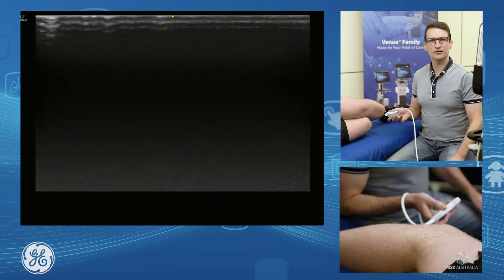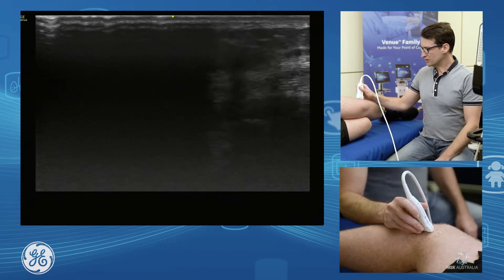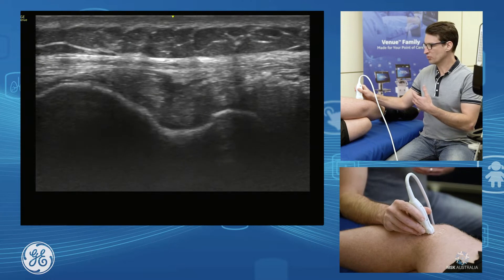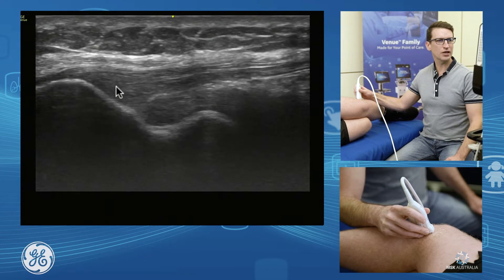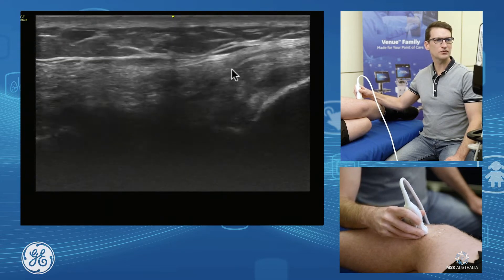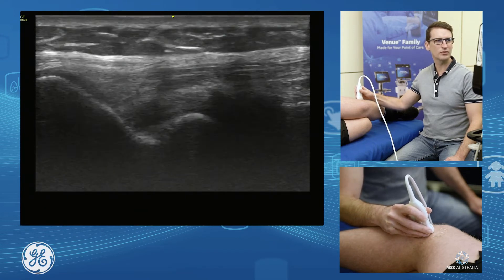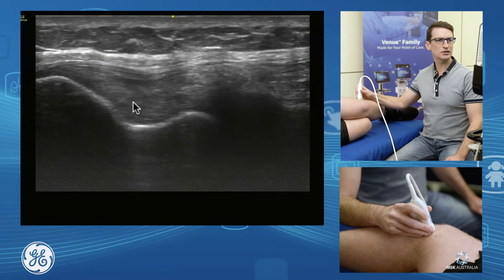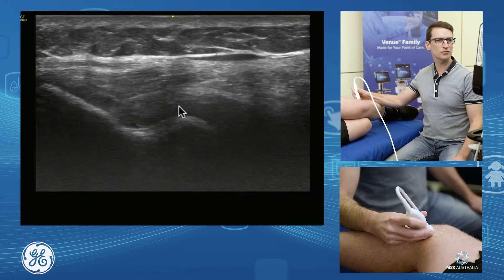Starting with our lateral collateral ligament — it isn't a true coronal view; we just need to drop that distal edge of the probe posterior a little to appreciate it. We can see it running from our lateral femoral condyle down to our fibular head. Just sitting deep to our lateral collateral ligament here is our popliteus tendon, which we can see running deep and around towards the back of the joint.